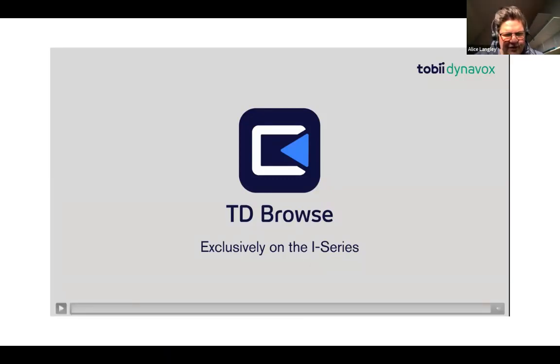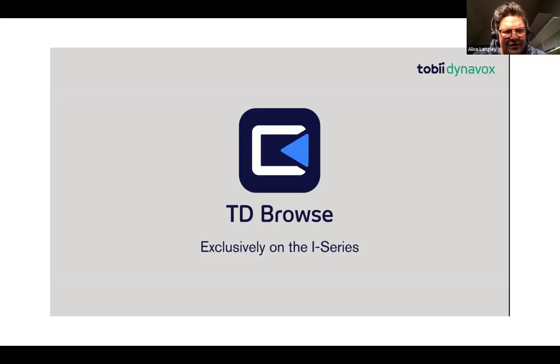So hopefully that gave you a bit of an idea of how that works. TD Browse, as I said, is specifically designed for eye gaze users to access the internet. And the importance here is again looking at people being independently able to search for things on Google, purchase things on Amazon, look at videos on YouTube, whatever it might be.